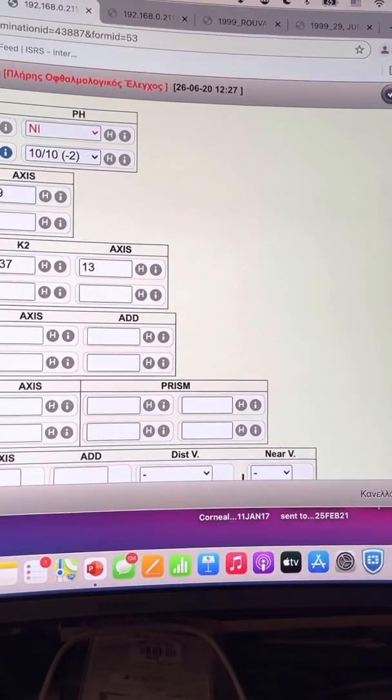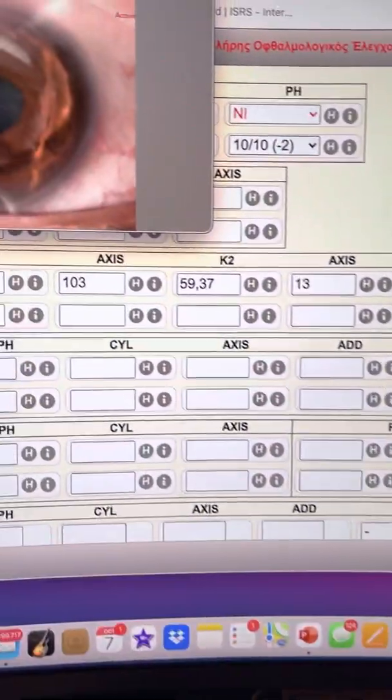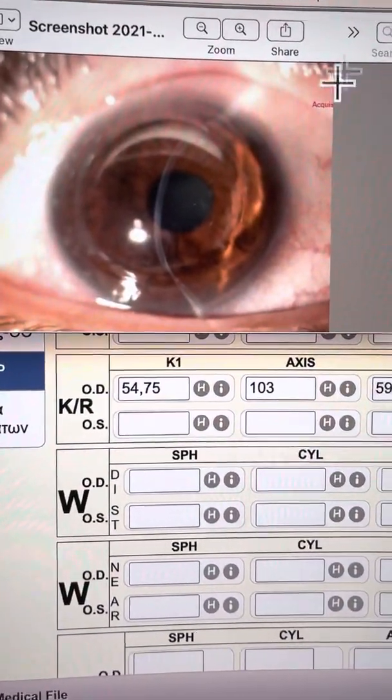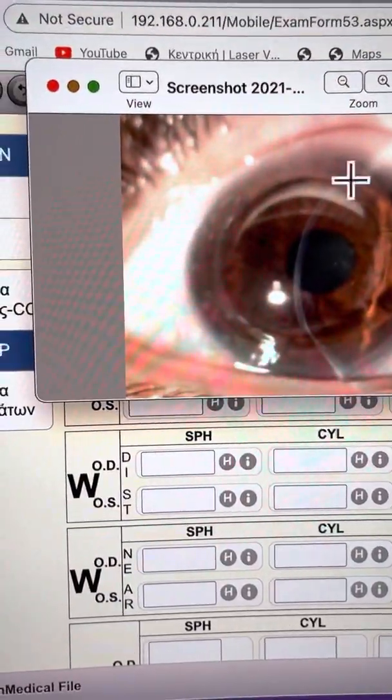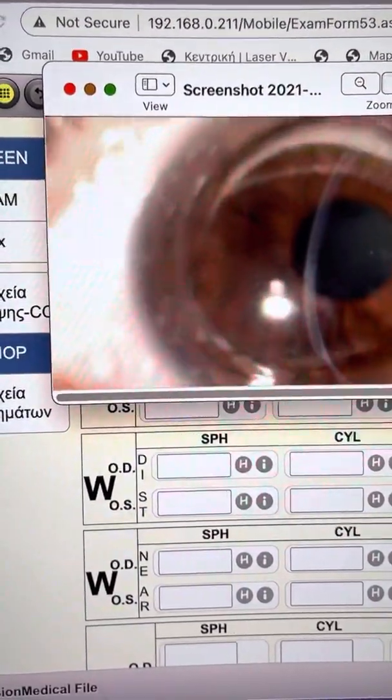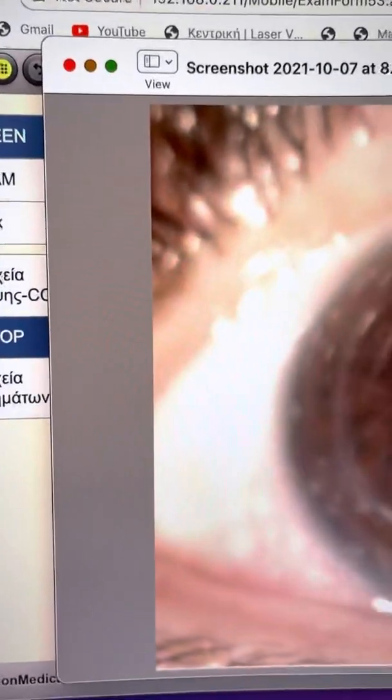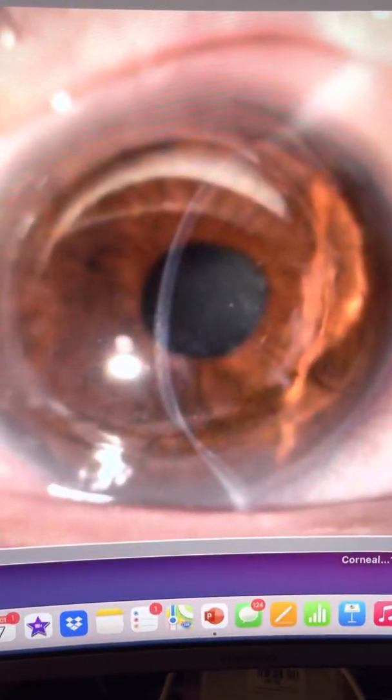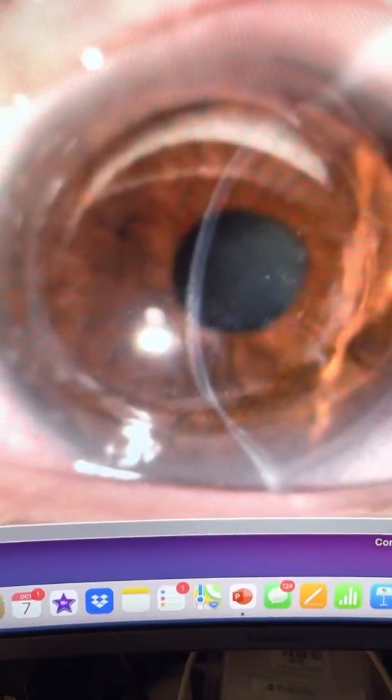This is a patient who had undergone a cornea transplant several years ago. And this is the cornea, how we encountered it last year. And of worth here is that his refraction gave over eight diopters of astigmatism. He was uncorrected, count fingers.